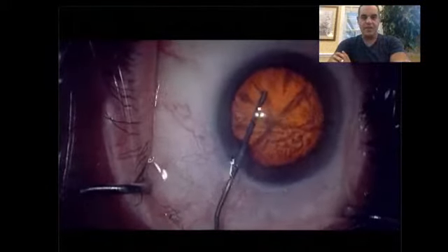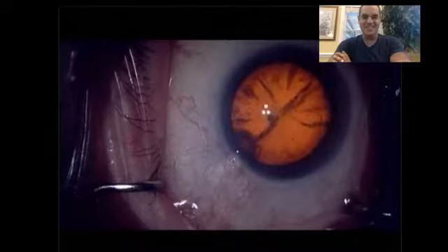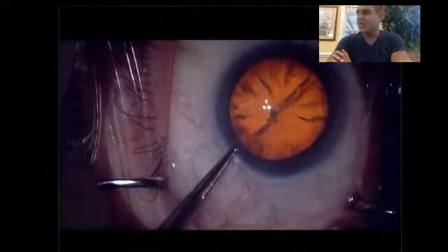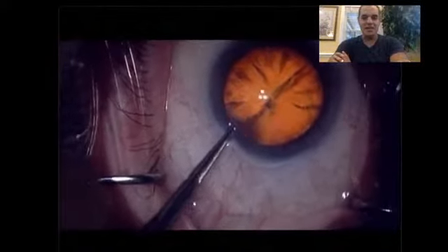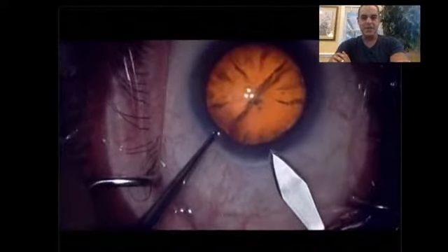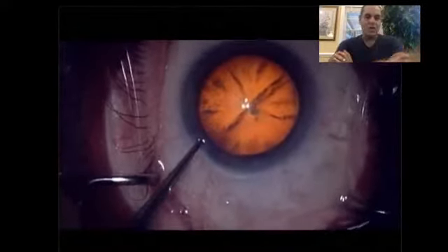So we make the paracentesis incision, and then we go in with viscoelastic and inflate the eye. I also put in preservative-free lidocaine before that. I stabilize the globe using 0.12 forceps. Those of you who have seen my videos know that I really like that technique. And then I use a 2.4 millimeter keratome blade.